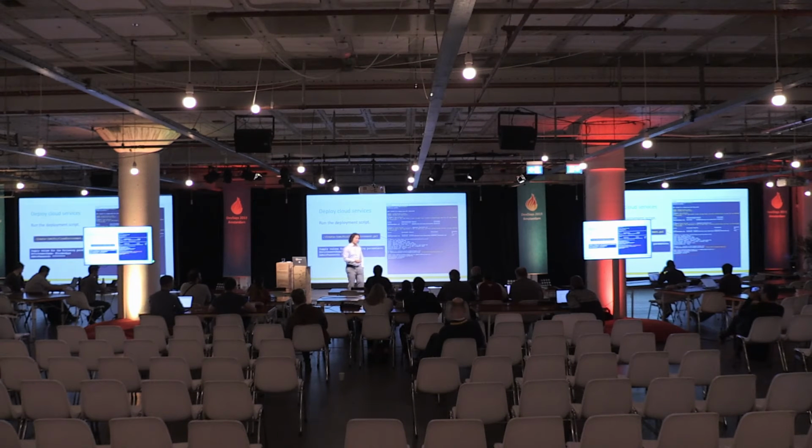So this is kind of a tricky part here, but the 2 parameters are going to be environment name and then an admin password. The environment name has to be unique because it creates a subdomain for your services. So don't use FHIR DevDays, use a pet name, use something. The other requirements are that it has to be lowercase, letters or numbers. And then the admin password, it's actually going to print this password out in plain text, so don't use the password for your bank account or your Twitter unless you want it stolen.